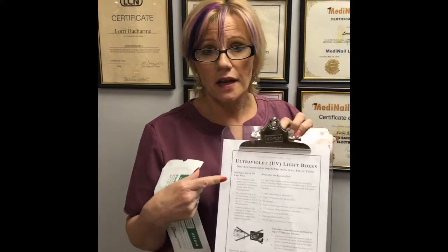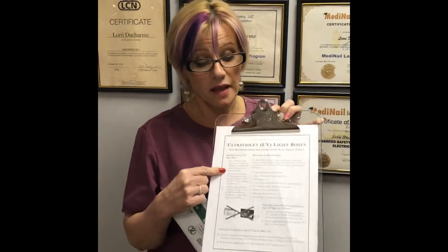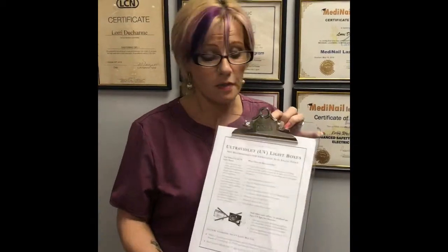UV light only gets to whatever surface it's exposed to on the top of the bag. Even if you did not bag the implements, UV light does not get into cracks and crevices, it does not bend corners, and the bulbs often lose their intensity over time and get dusty and should be replaced. These are not sterilizers — they're just holding boxes for things that have been properly disinfected and/or sterilized. That's a big misconception going on right now.